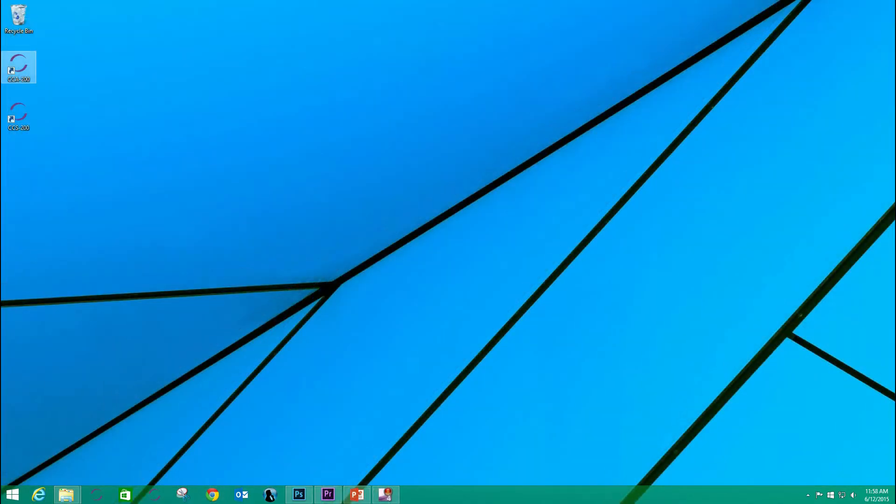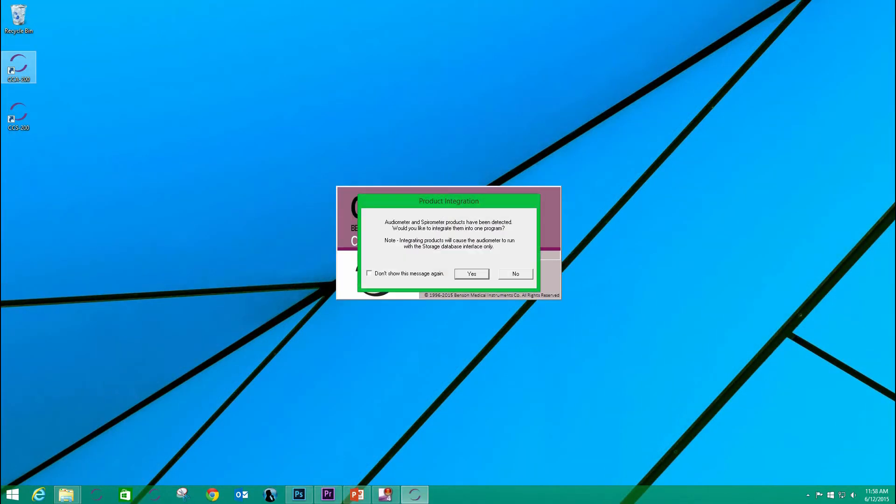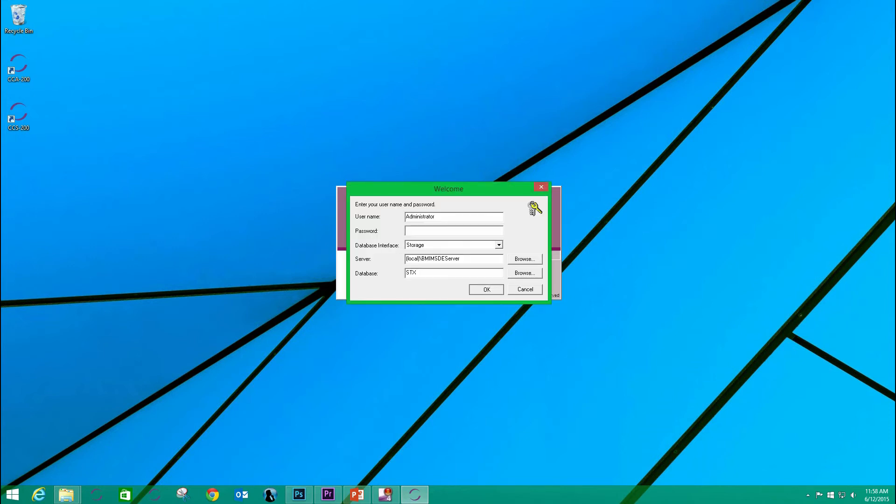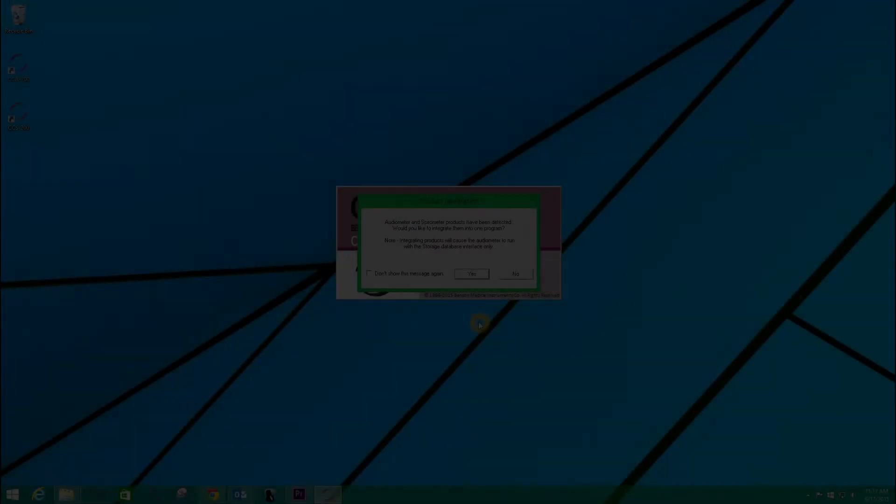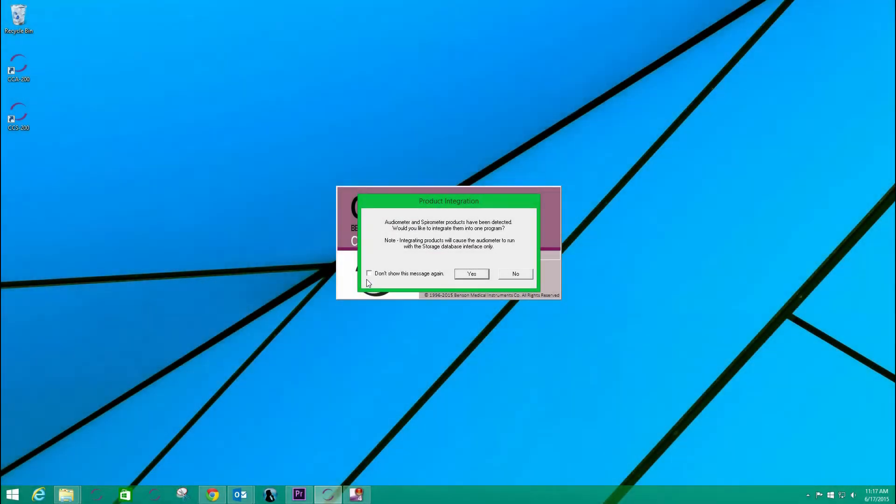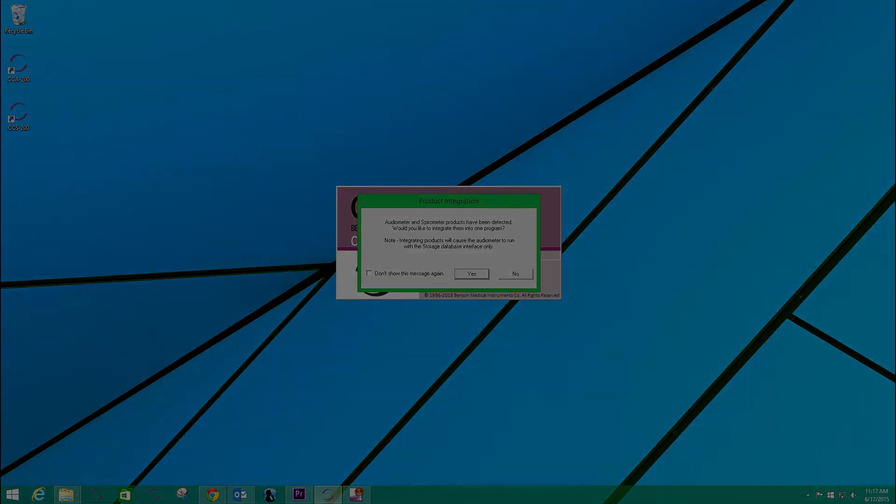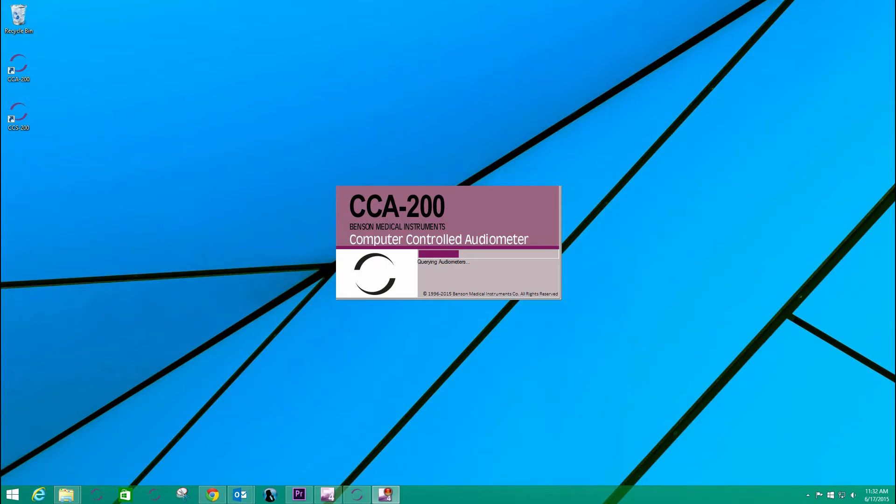You may have noticed that each time I launch the software, one of the resulting dialog boxes asks whether I'd like to integrate the two instruments. I've answered no so far, but this time I will answer yes. Note that there is an option to make this choice persistent. Since I have not chosen this, I am queried each time.